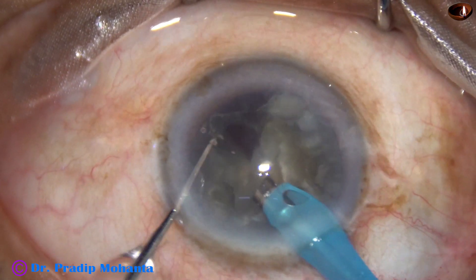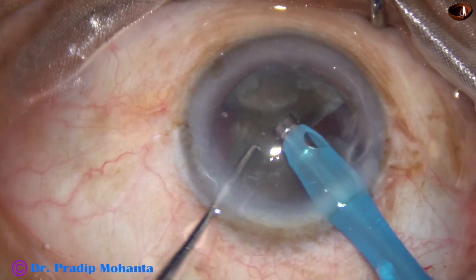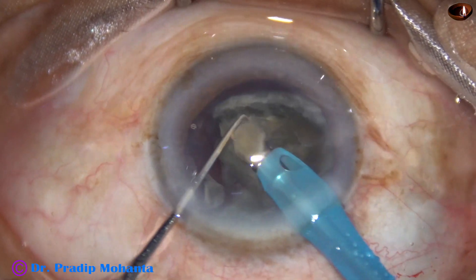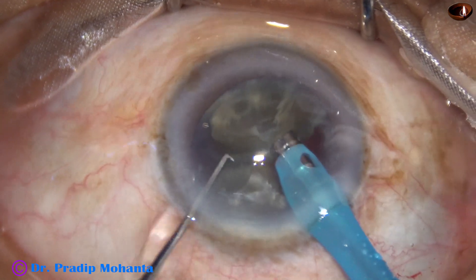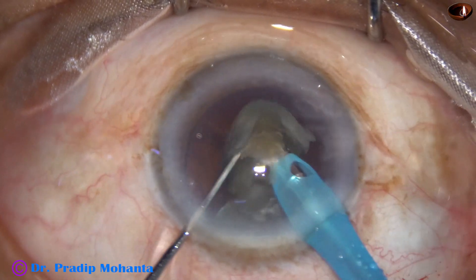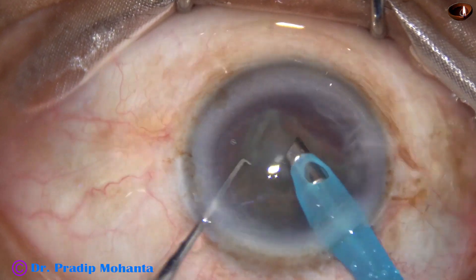Ultrasonic energy used is 85% in continuous mode. By this time one hemi-nucleus has been emulsified. This is the other hemi-nucleus — it is a large fragment and it is being emulsified slowly. This is the last fragment.